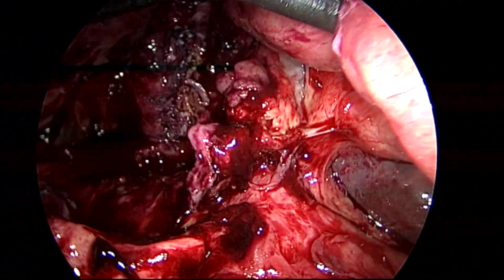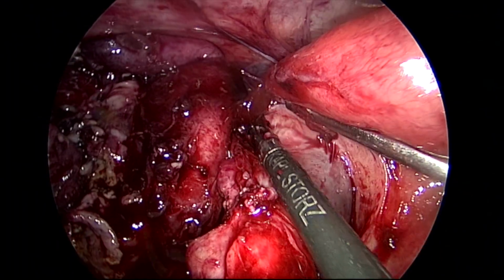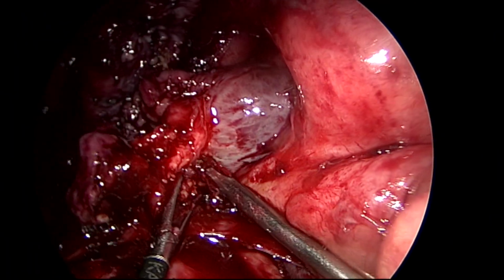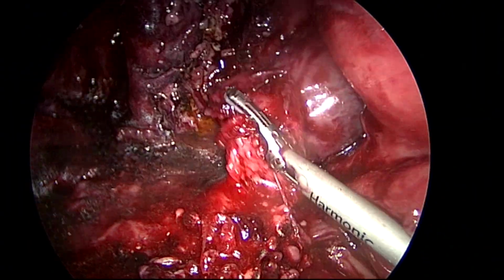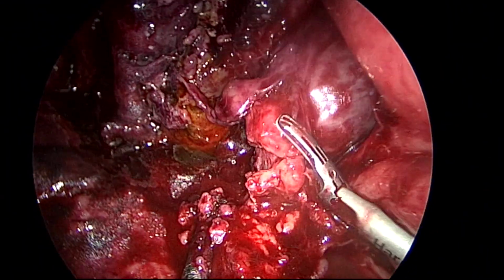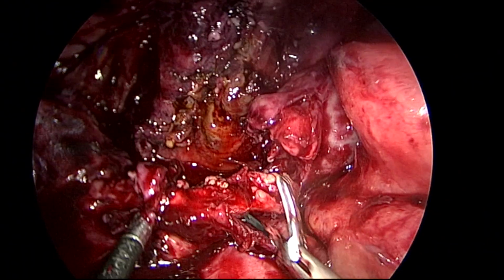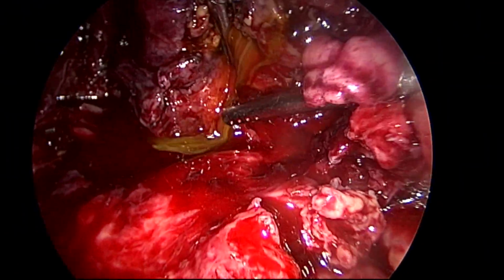So, once I identify this portal area, then I know I can go down. Now, these are the dense adhesions on the quadrate lobe of the liver. This might be the perforated gallbladder, and the omentum goes and is adherent to the surrounding structures. So, I am releasing the omentum. Now, I could see the porta is there.